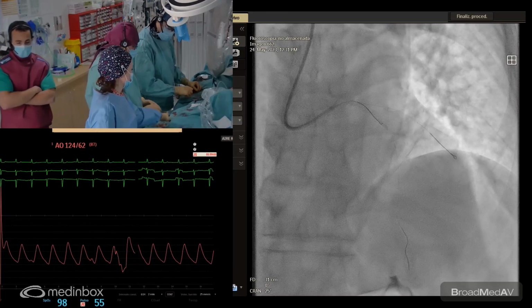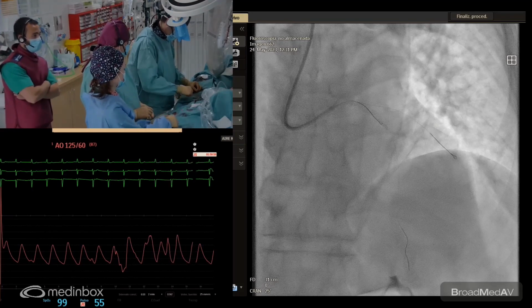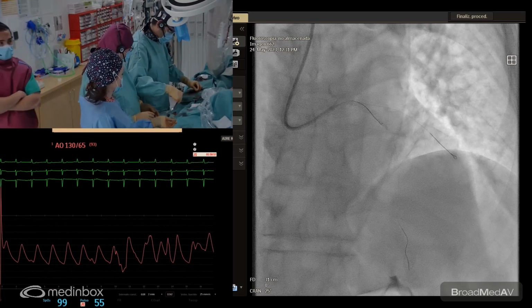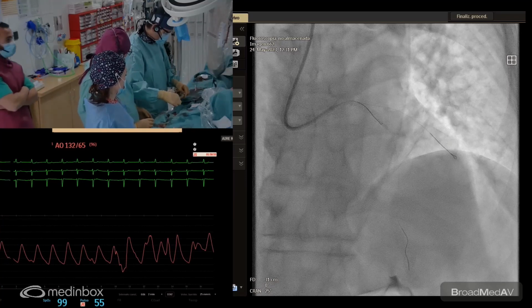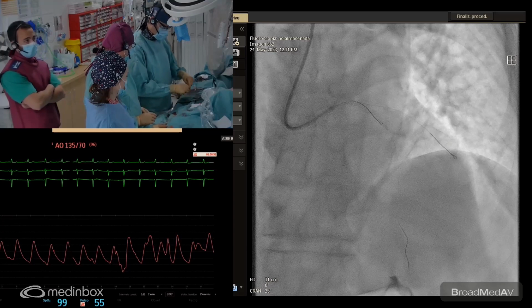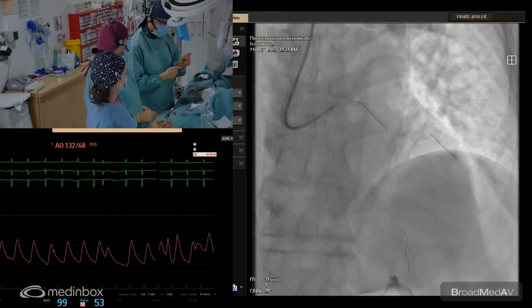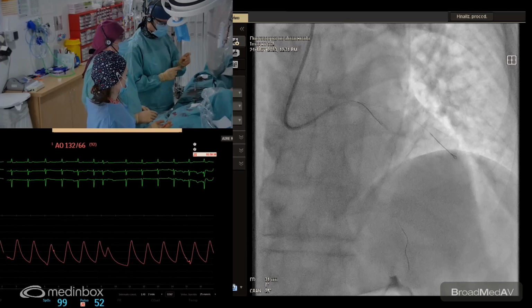Yes, the aneurysm doesn't have anything because it's quite big. I'm going to change the curve. And if not, we can use a dual lumen microcatheter or just leave it without protection because we have dilated with a shockwave balloon and this diagonal is the same now. Probably the aneurysm hampers the crossing to the side branch, but also protects it from being occluded.